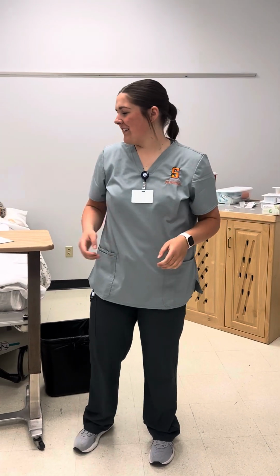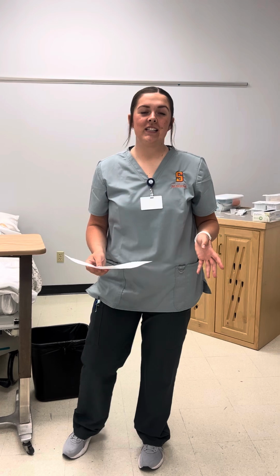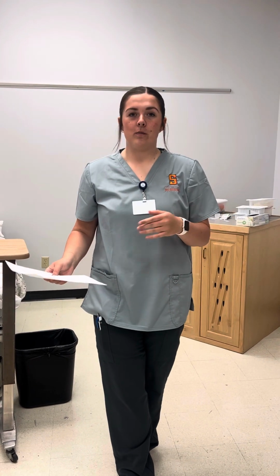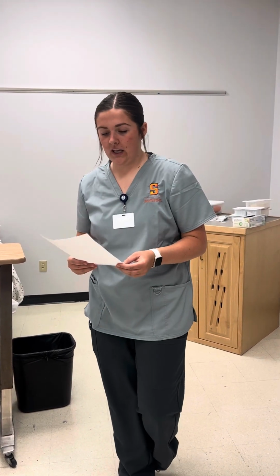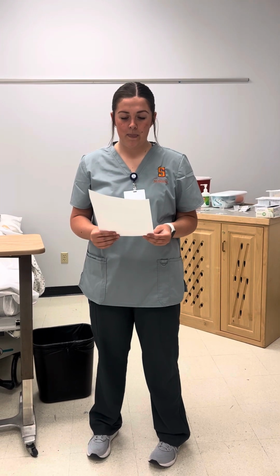All right, today we are going to be assessing our patient and giving her medications and performing a procedure, which is a Foley catheter. Our patient is Glenda Kronk. She's a 35-year-old female who presented with pneumonia and obesity. She has a history of hypertension and hyperlipidemia.